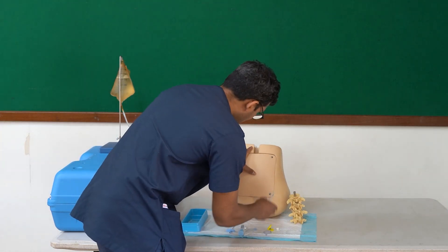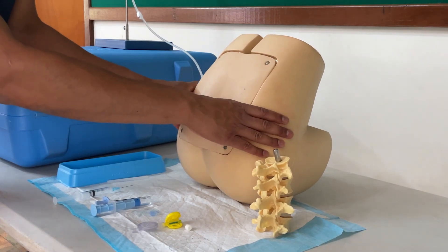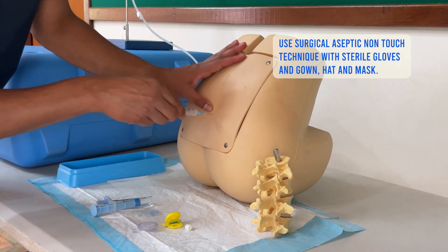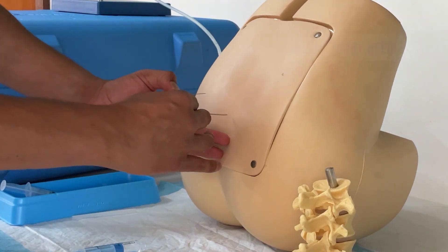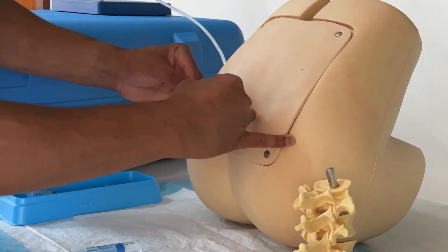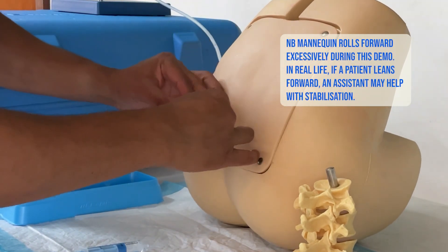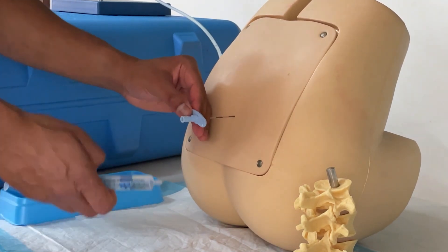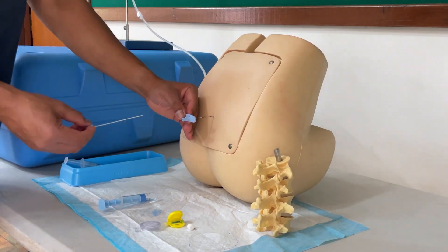Just as with a spinal anaesthetic, I locate the appropriate space — I use Tuffier's line in the midline to locate the L4 vertebral body and go just below that. I inject some local anaesthetic, find the space, and leave the finder needle in. I then take that out and put it aside safely. I insert the epidural needle until I get down to about 3 or 4 cm, making sure I'm in the ligament, at which point I remove the stylet — this stops any skin particles from entering the needle.